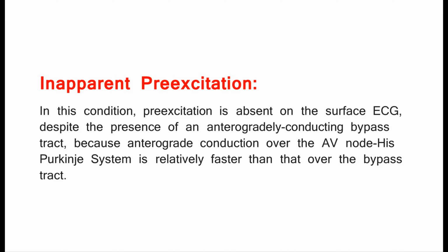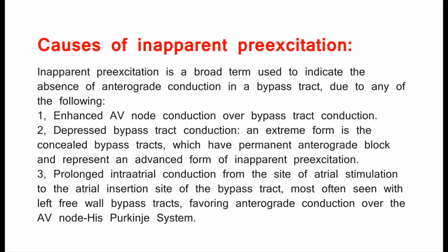Inapparent preexcitation. In this condition, preexcitation is absent on the surface ECG, despite the presence of an anterogradely conducting bypass tract, because anterograde conduction over the AV node His-Purkinje system is relatively faster than that over the bypass tract.